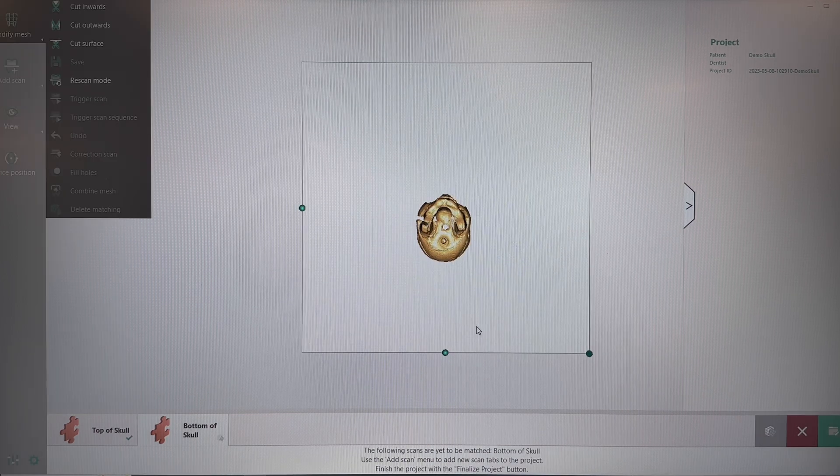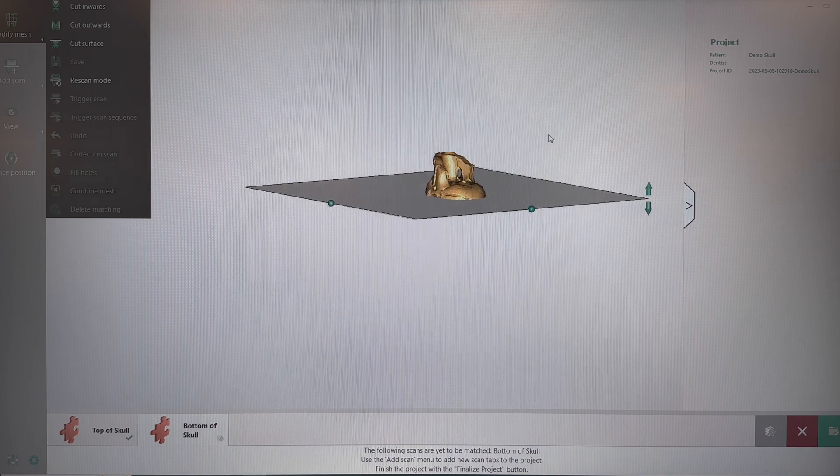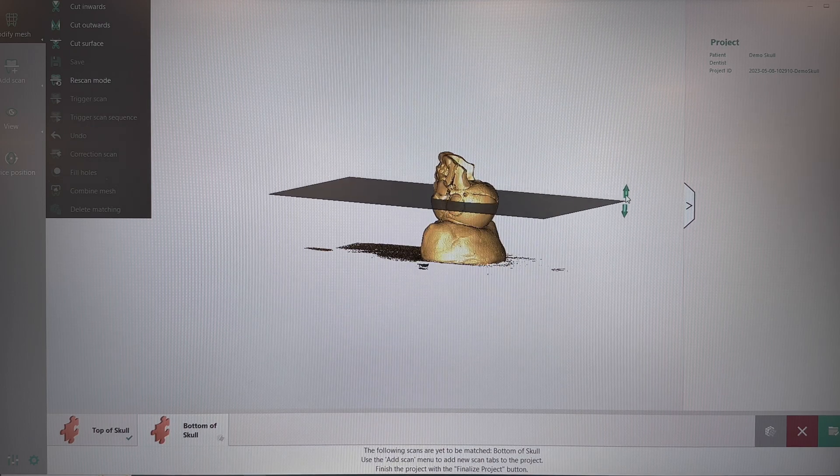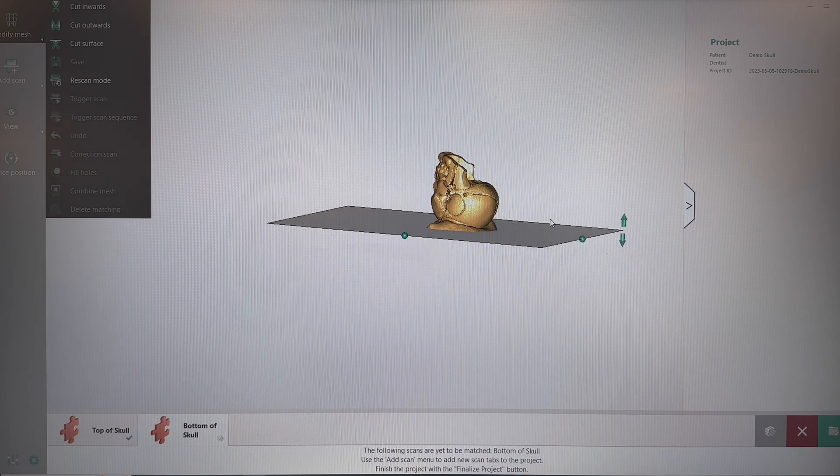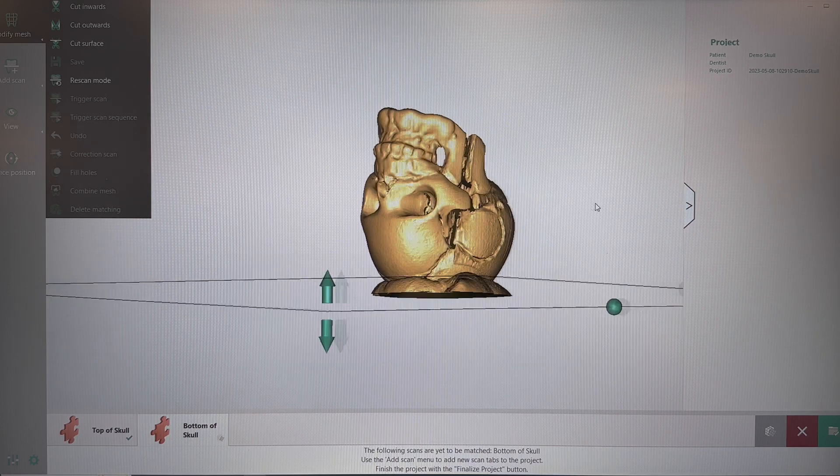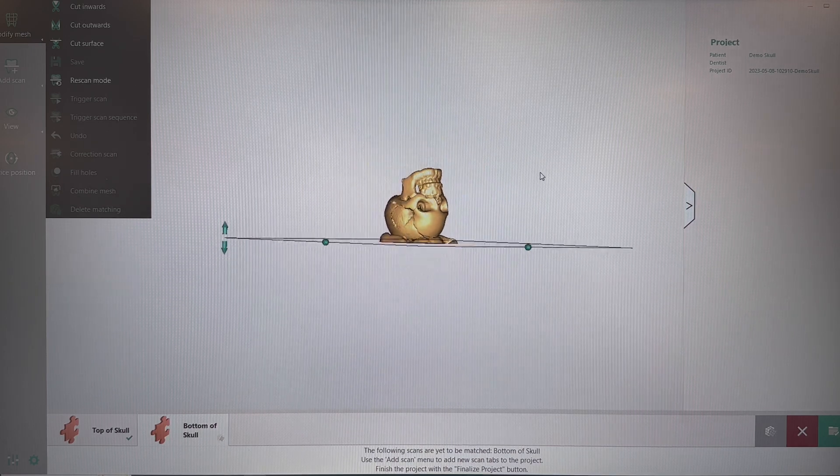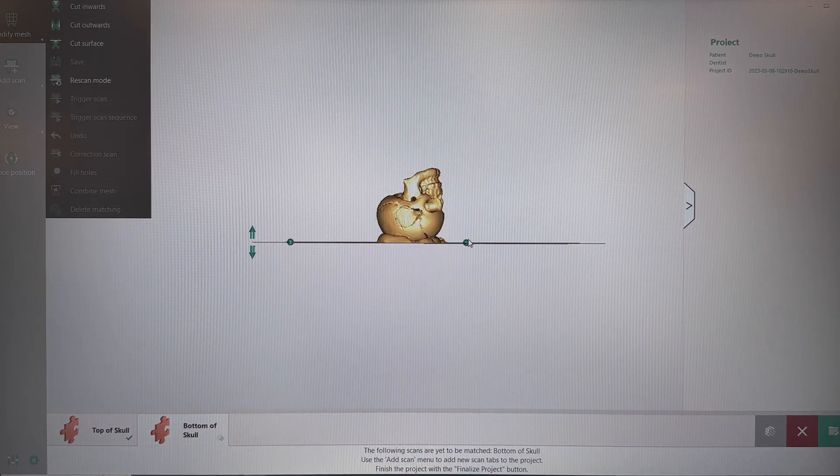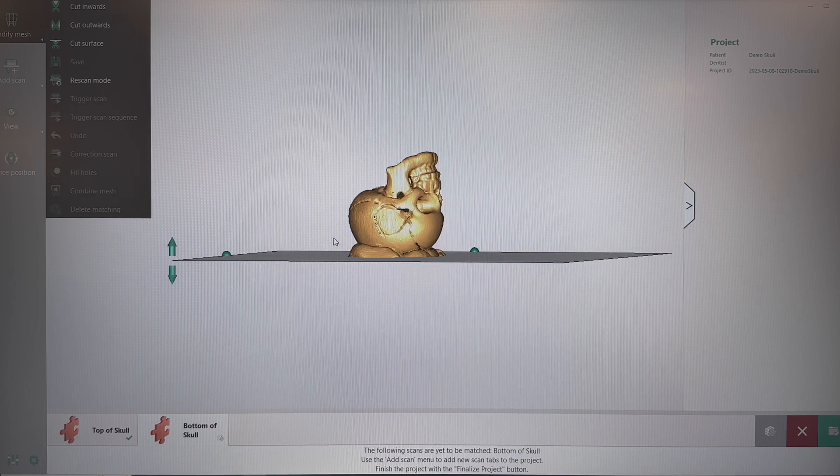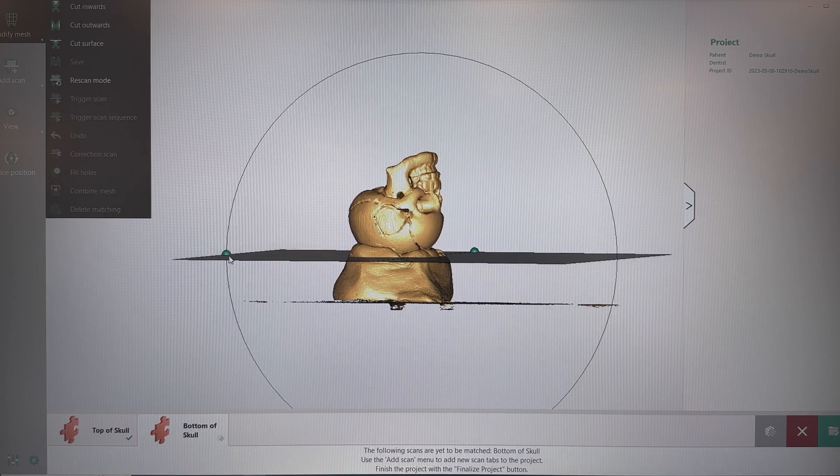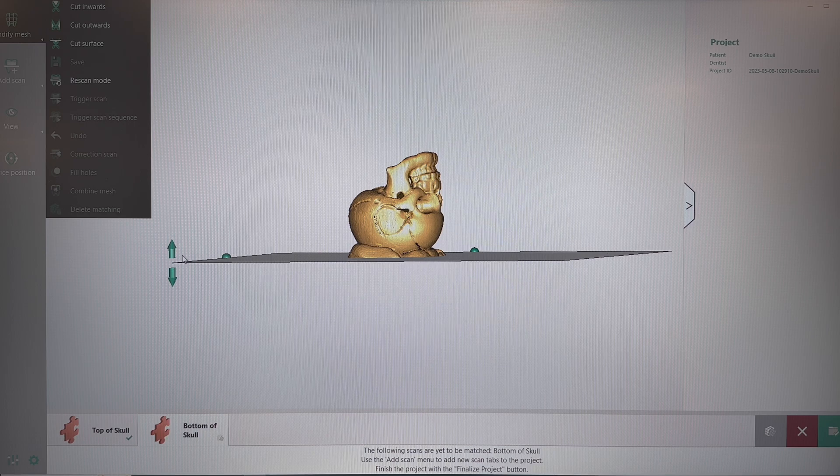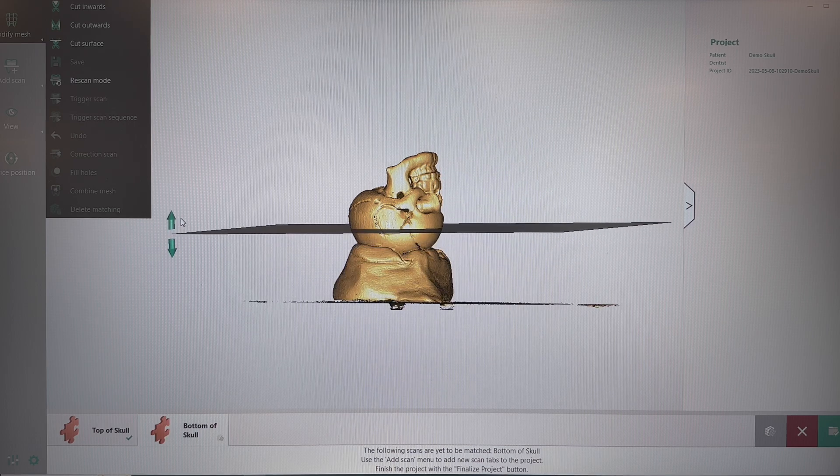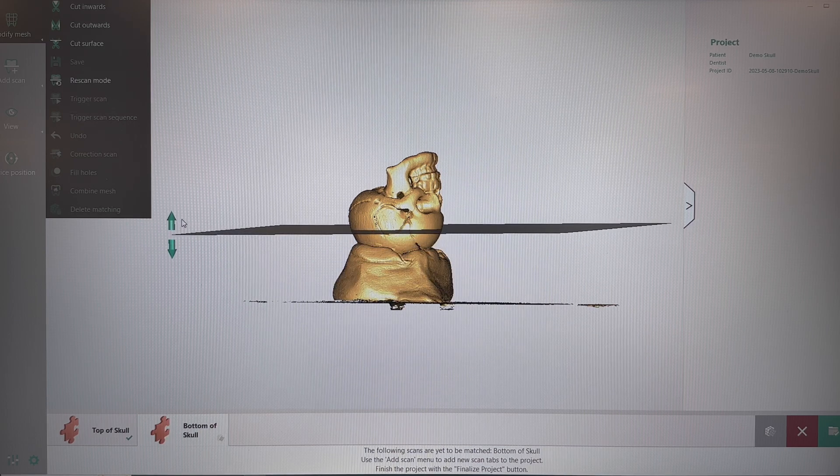Now we're going to need to trim the bottom part. Same thing, I like to get it horizontal. Use the balls on the trimming plate to get it horizontal as well. The up and down arrow to cut about half of it away. And then, once we're done with that, again, bottom right hand corner, we're going to click the Matching button.